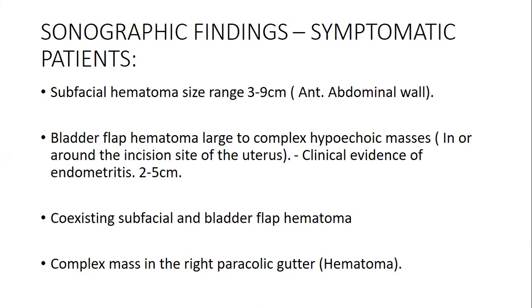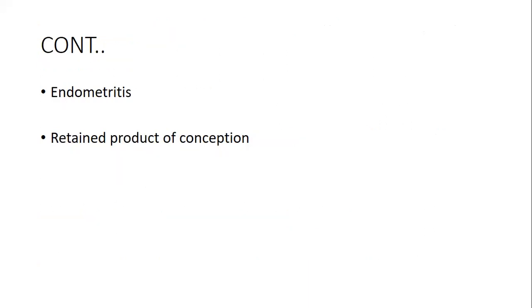So there is nothing wrong for a sonographer, when they bring a patient for post-cesarean section, you do the whole abdomen. You check if there is any fluid within the Morrison's pouch. Check around what may be going on. You may find that there is a lesion there. Again, you need to have very good equipment so that you can delineate the structures around, so that you are able to see even these distinct masses that you can see.